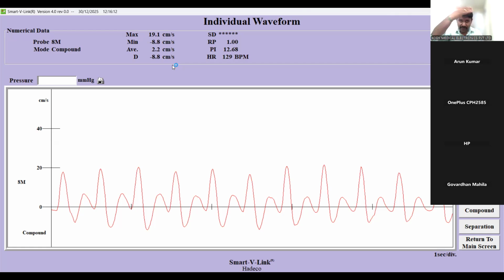So see, cost wise we may be a little bit higher, but we can even match the pricing of the competitor, and we can do that very well. I'm just telling you, due to some cost thing, they should not lose the quality of a Doppler. And also, for plastic surgeons, only the bidirectional Doppler is able to sense this critical, even a feeble flow.